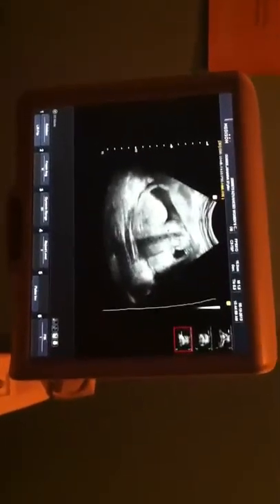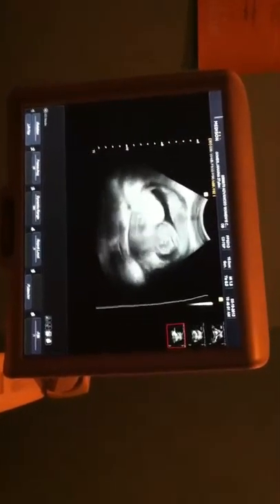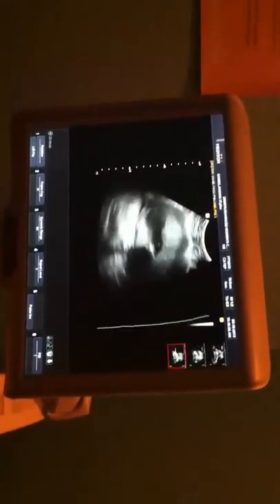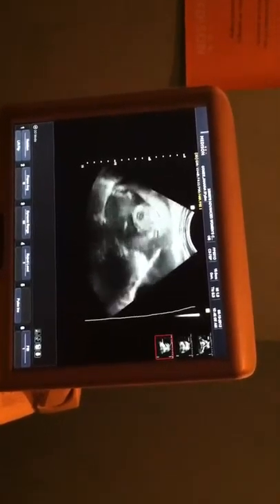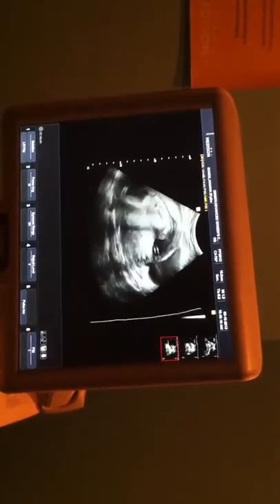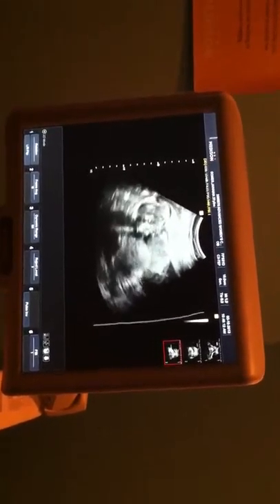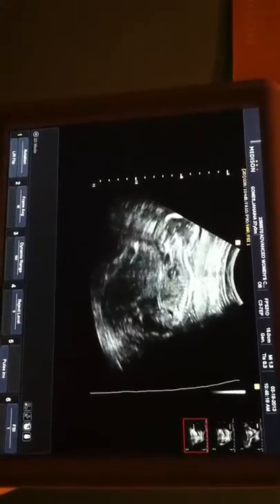Usually they'll start moving before I'm done. I just need to get this other stuff out of the way. Hopefully he'll move and we can see him a little better. He just won't. Can you see now? I can see.